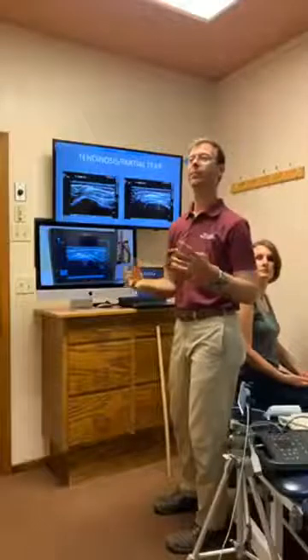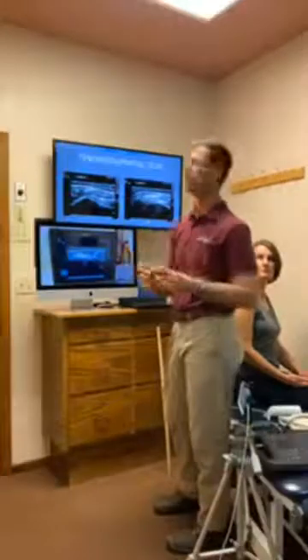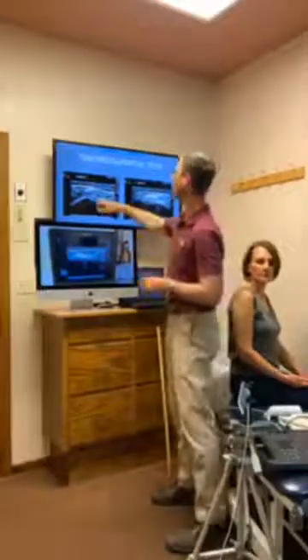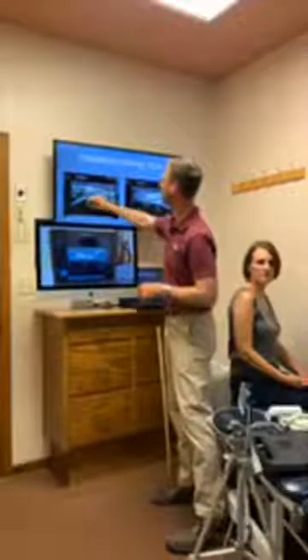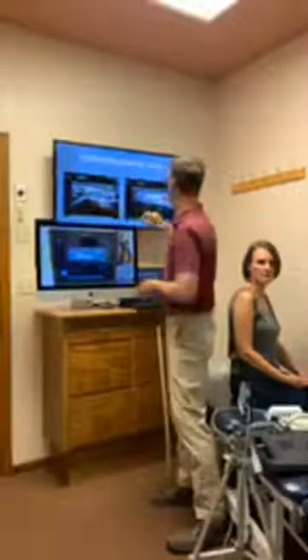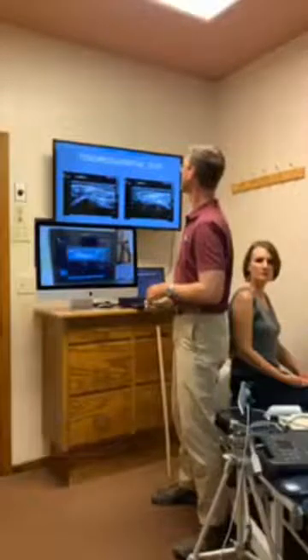And there's a fine line between the two, because with tendinosis, there's some fiber disruption. And so we have that hypoechoic area, that darkness. It's no longer got that nice bright white attachment up here on the bone. In short axis, you can also see that through here too. So we've lost some of that.